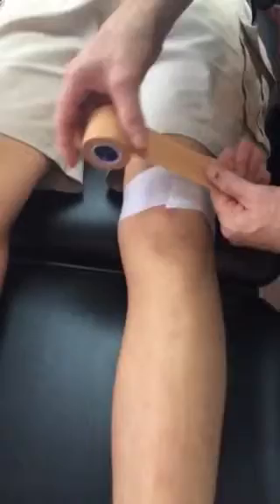Okay, so when you put tape around, it needs to go all the way, not halfway. It's got to stay on. Number two - you need to have this on the inside. We don't want it here; it compresses the knee joint too much. And we pull it across.